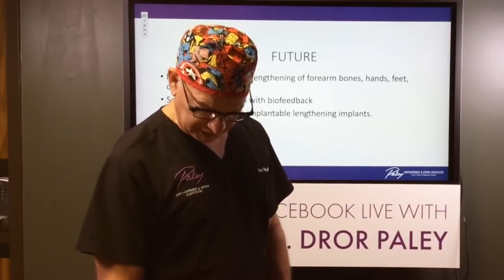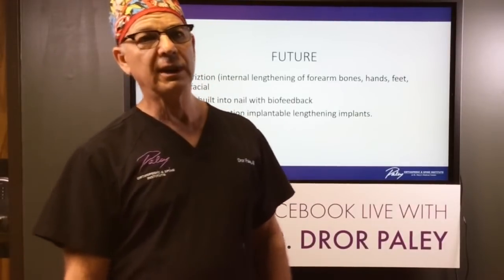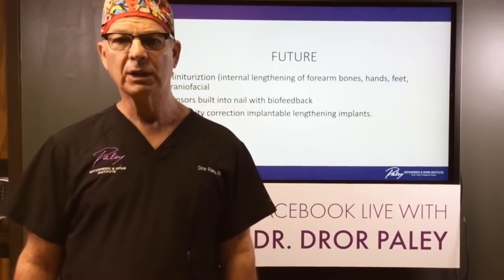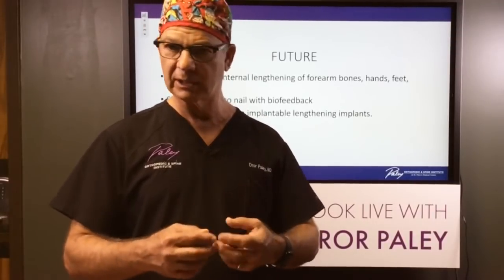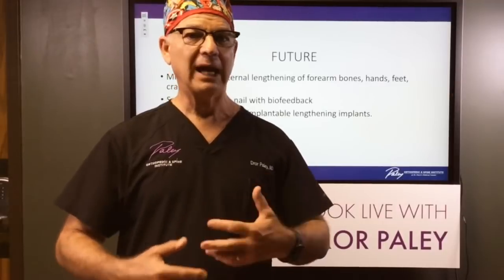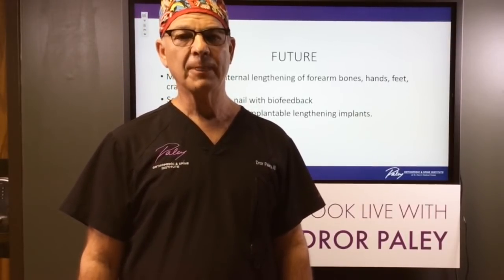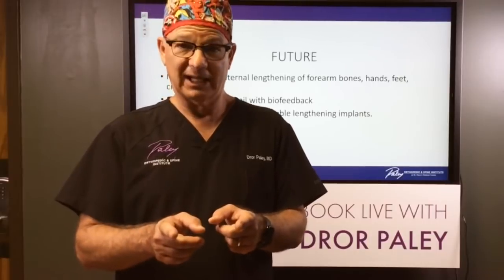Okay, remember, a patient with a leg length difference already has a shorter bone than another patient of that age. Because that's why they have a leg length difference. All right, so we are challenged by length, diameter. We're challenged by the presence of growth plates. So all of these go into the decision of, can I use an external versus an internal? The other part that goes into it is deformities. There's no question external devices can more easily correct deformities and can do it very safely and very accurately. Internal devices have more limitation in that respect.